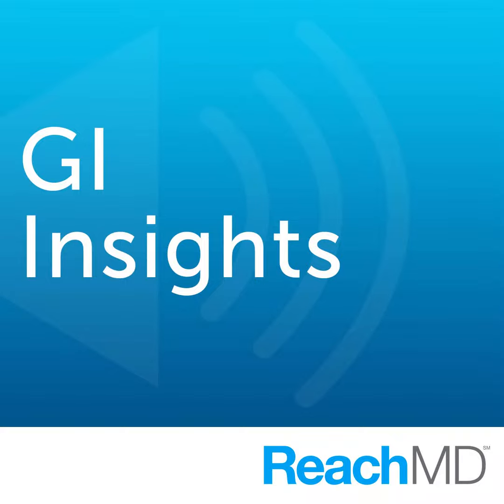So, in fact, you're getting a microscopic image that we're used to seeing through a microscope on the video imaging? Yes, that's correct. And essentially, as we perform endoscopy to look at the digestive tract and the cells and tissues on the surface of the lumen of the esophagus, colon, small bowel, stomach, we can see in real time the features of the cells and tissue live and be able to study and understand their function.